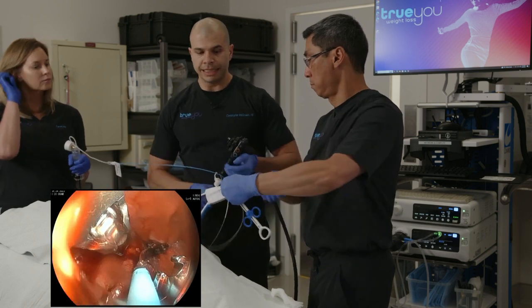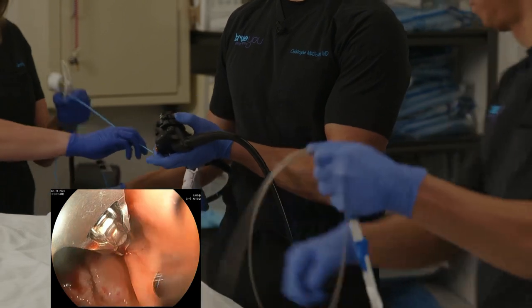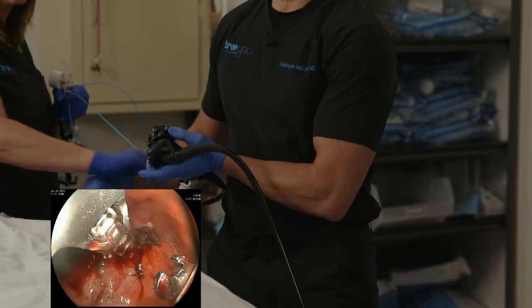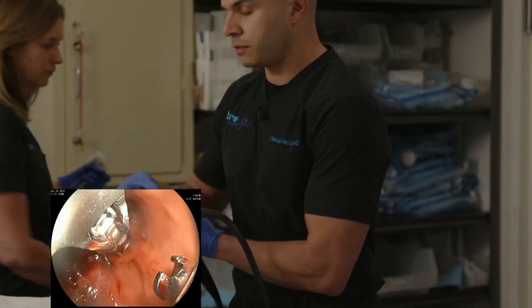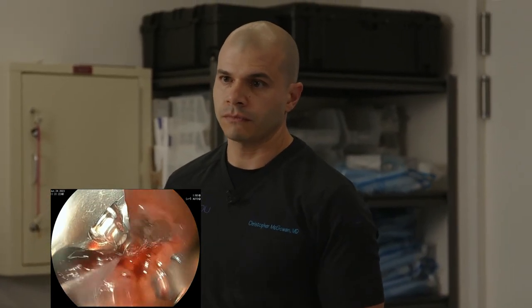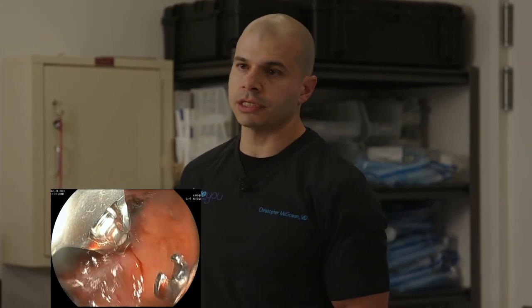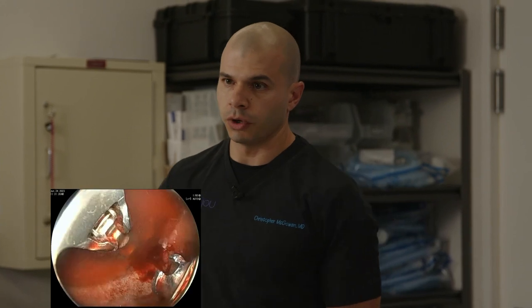All right, so that's exactly 8 millimeters. We're done with the balloon. The balloon comes out now. So we've gone from around 30 or so millimeters to begin with to exactly 8. And you can see that. And then I'm actually going to reinforce this just proximal to the anastomosis. And then we'll work on the pouch here. So we want to add a little bit of extra strength to the anastomosis.